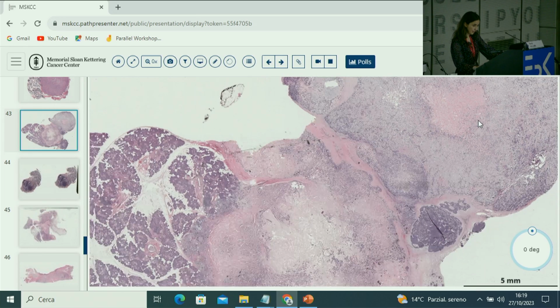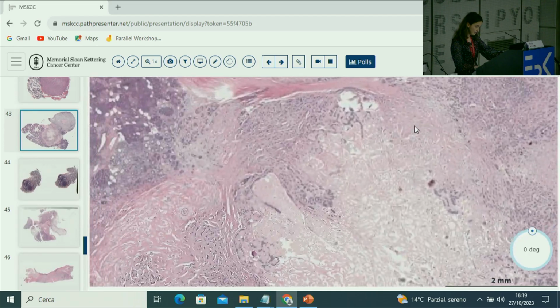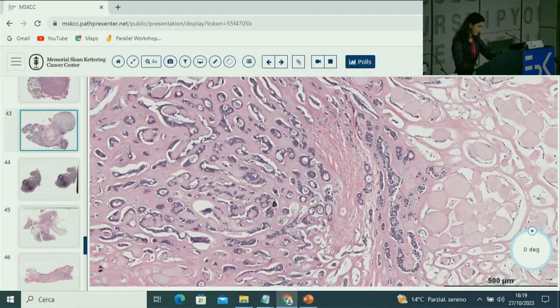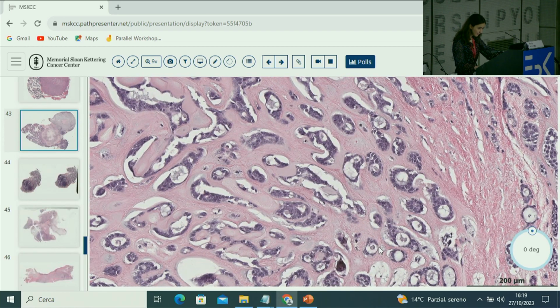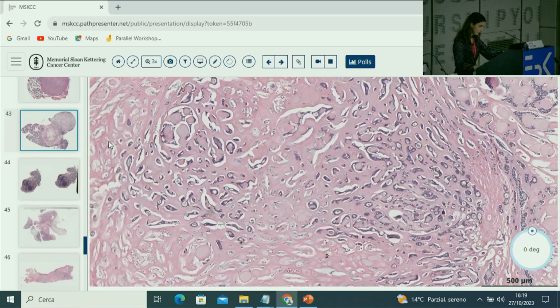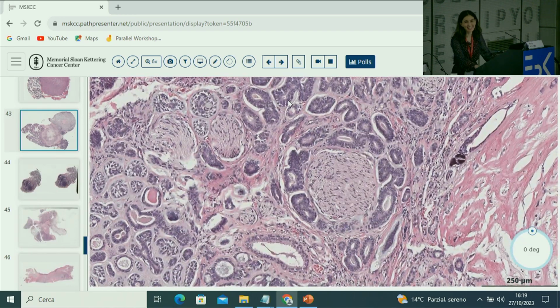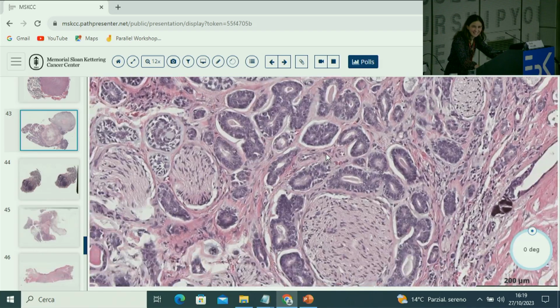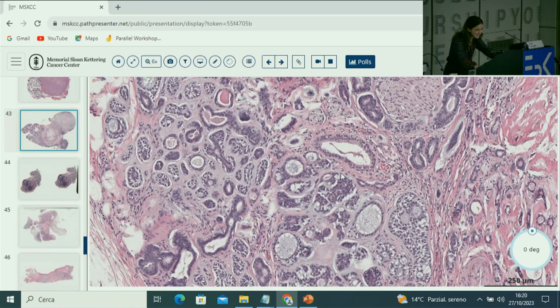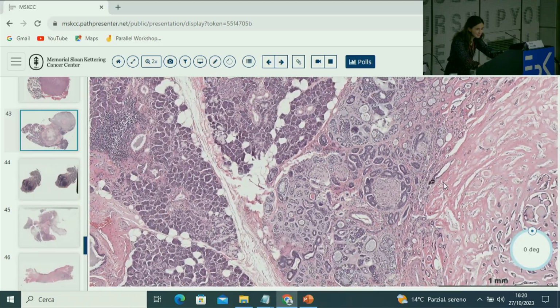That's a nodular area, right? Lot of hyalinization and sclerotic stroma. There's duct formation. No. No. It's not, but this area makes it easier. So what do you think? Adenoid cystic, yeah. So here we see the typical small cribriform and tubular pattern, but notice these areas here, very hyalinized, and the cribriform can be very diffuse.